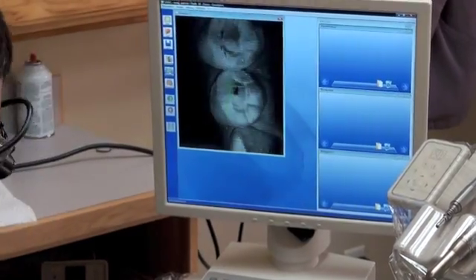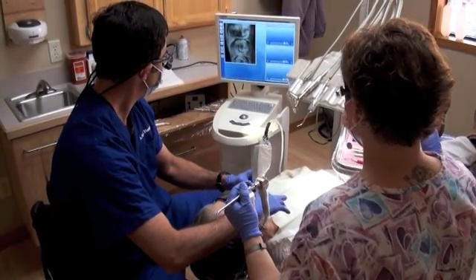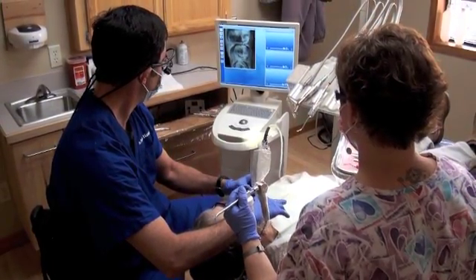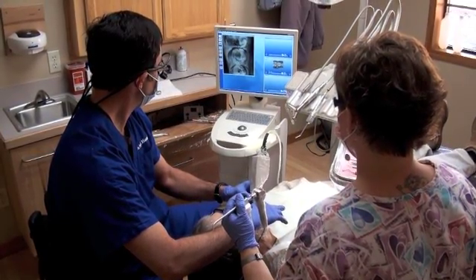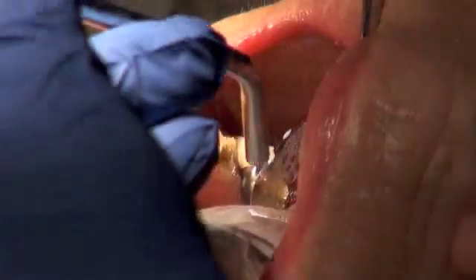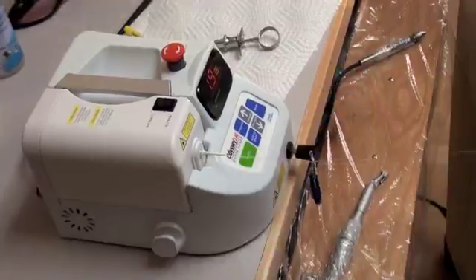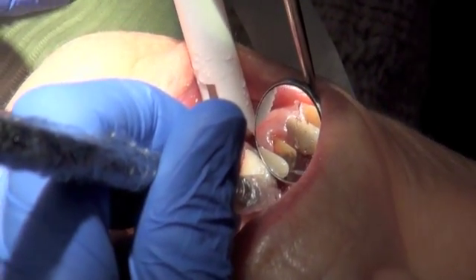An image was taken of her old crown's anatomy after checking to make sure that her bite was perfect. Her existing anatomy was copied, as there was nothing wrong with the shape, contour, and bite of her old crown. The crown and the decay were then removed. Notice the isolation mechanism at the bottom of the screen — this mechanism helps evacuate the mercury vapor from the old amalgam filling that the previous dentist had left underneath the old crown.